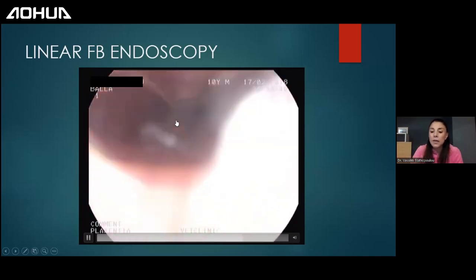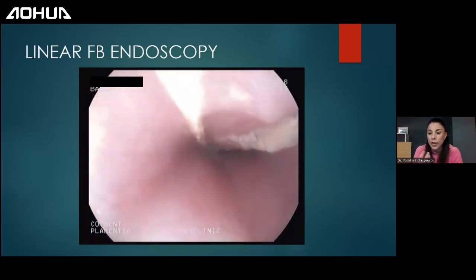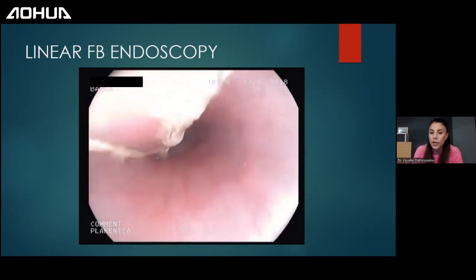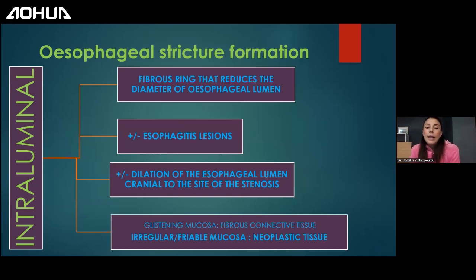And this cat had ptyalism, hypersalivation. Of course, the string was underneath the tongue and it could not apprehend the food. Very painful, not only swallowing, but eating, regurgitation. We would reach a point where, with severe esophagitis, it would form a stricture. When these patients are admitted to us, we have the fibrous ring that already formed, that reduces the diameter of the esophageal lumen. Very few cases have active esophagitis. Most of the cases that need balloon dilation of the stricture come with an already formed esophageal stricture.